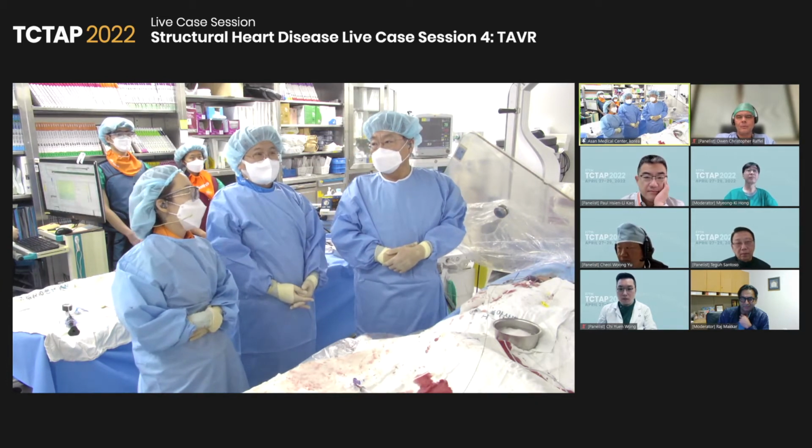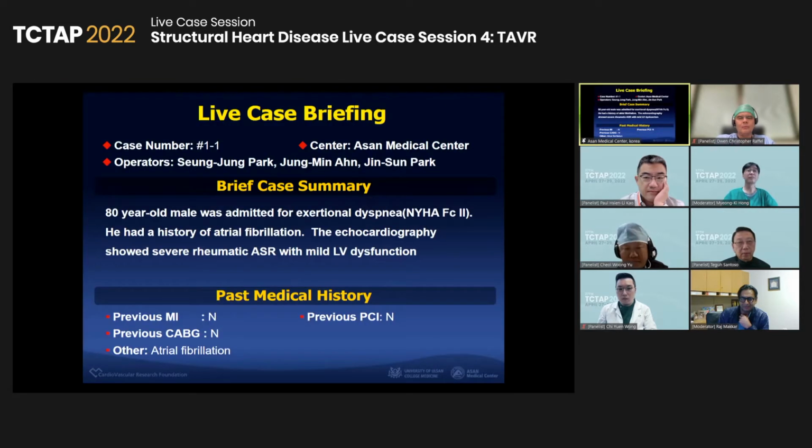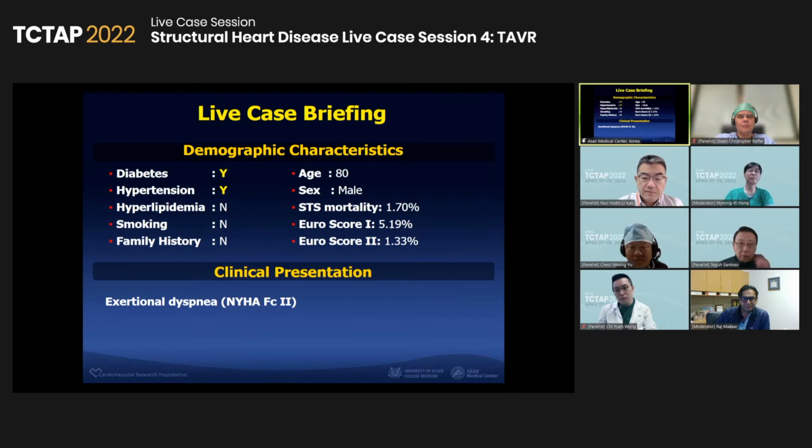I'm Jinsun Park from Asa Medical Center. This patient is an 80-year-old male. He was admitted for exertional dyspnea with NYHA functional class 2. He has a history of atrial fibrillation, and the echocardiography showed severe rheumatic AS and AR with mild LV dysfunction. He has several risk factors, diabetes and hypertension, and his STS score is quite low, 1.7%, and his clinical presentation is exertional dyspnea.